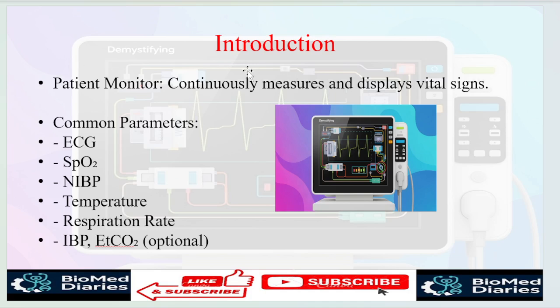So introduction, what is a patient monitor? Briefly, a patient monitor continuously measures and displays vital signals. Vital signs are the common parameters like ECG, electrocardiogram, SpO2, saturation of oxygen, NIBP, temperature measurement, respiratory rate, and optionals are IBP and ETCO2. ETCO2 will measure the carbon dioxide in respiration.